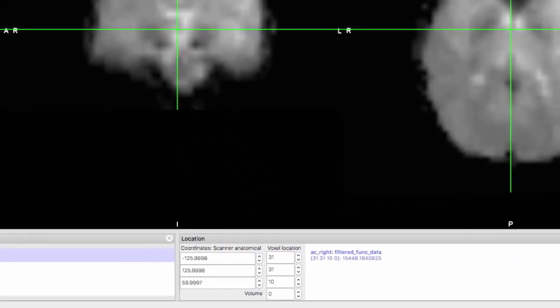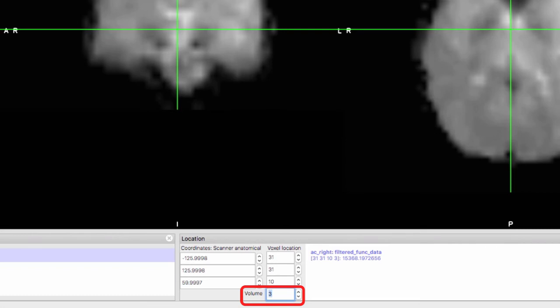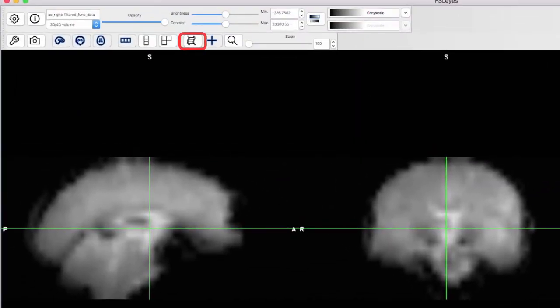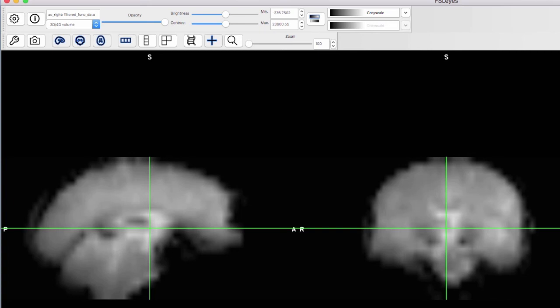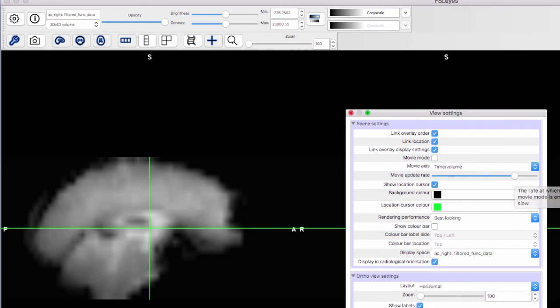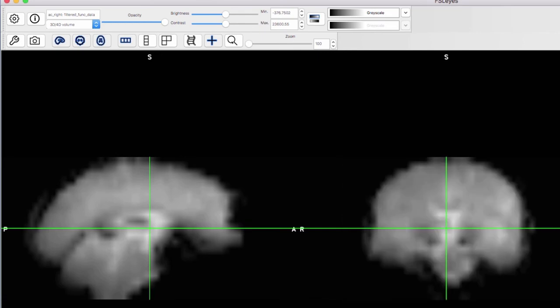You can also flip through volumes by clicking on the rocker button next to the volume box, or enter a volume number. You can automate this with movie mode, which displays consecutive volumes at a constant rate. This can be useful for detecting motion artifacts. To change the rate of movie mode and to see other display options, press the spanner button. You can then increase or decrease the movie update rate by moving this slider.